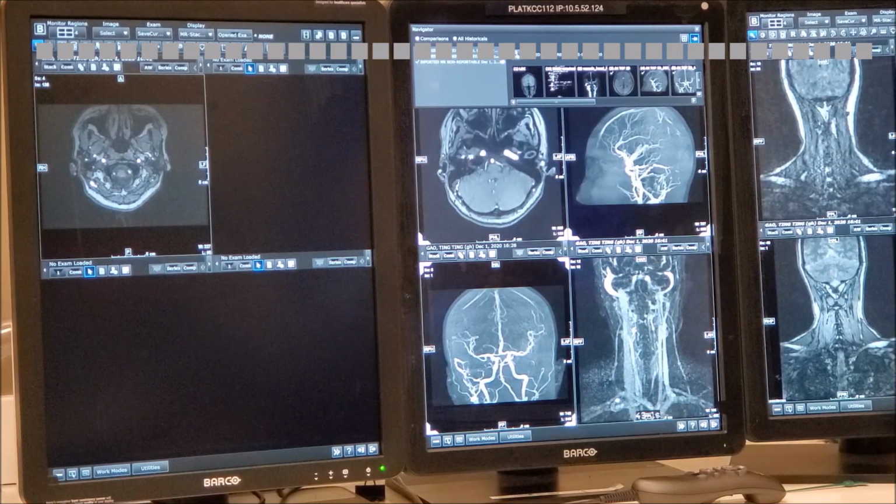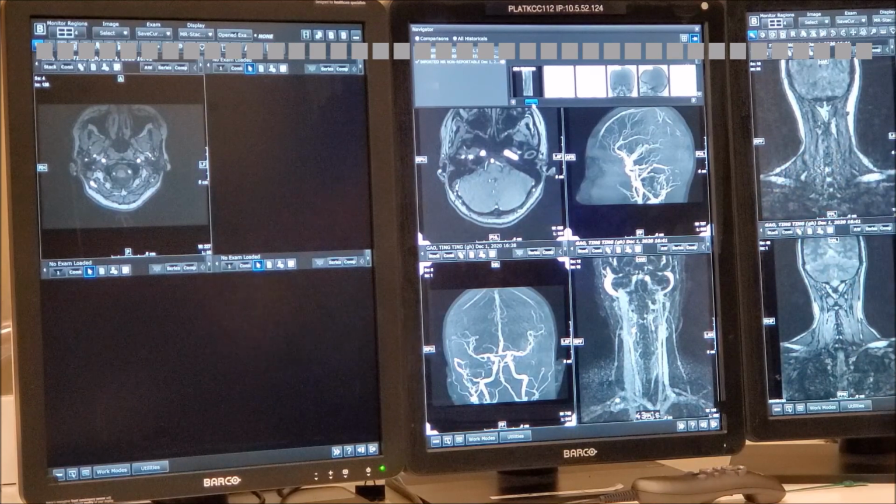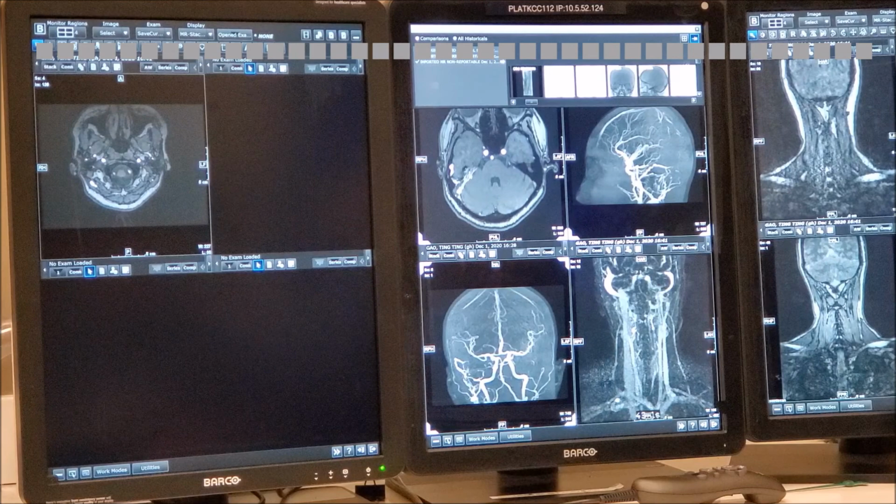Now let's go into the angiogram. Now the patient's only complaint was noise. Okay, no cranial nerves, nothing like that. In the posterior fossa, right? We know where it is. You knew the diagnosis before the angio. Okay. So what is your protocol? How do you work it up?